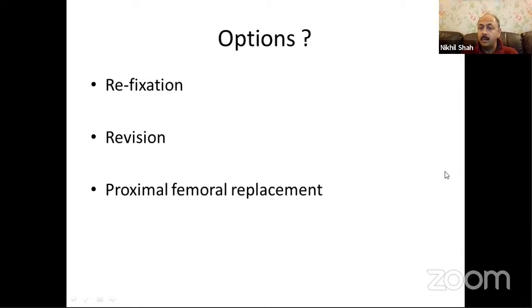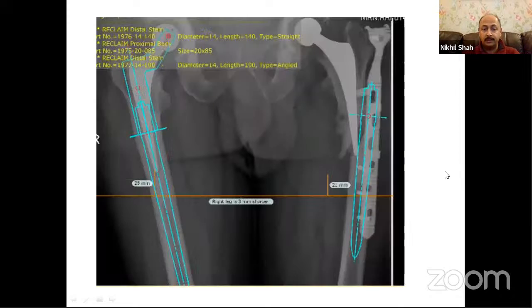But in a young person, when you do that, you eliminate all future possibilities of reconstruction. And when a proximal femoral replacement starts dislocating or it fractures below the tip, you have nothing left but a TFR. And if it gets infected, we've inherited some patients where the options have been a hip disarticulation. So my philosophy is to try and be as conservative as you can, try and save as much bone as you can. So this was the planning, the various different lengths of stems and plates, and you have to keep available everything on the shelf.